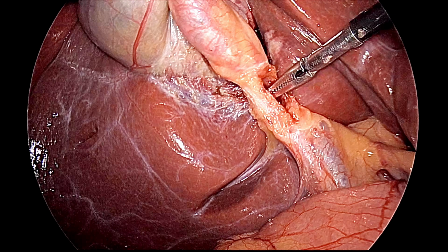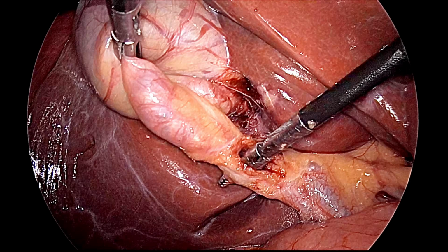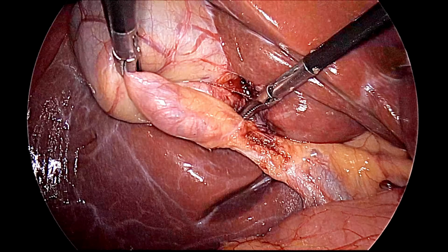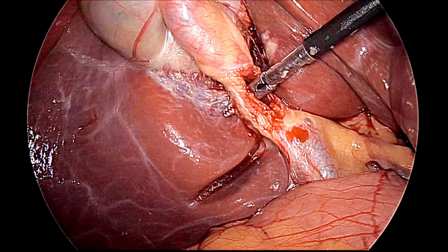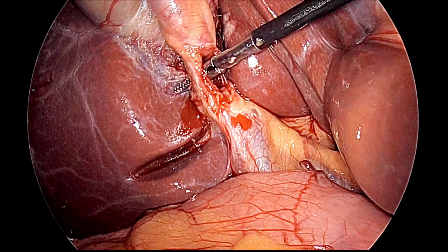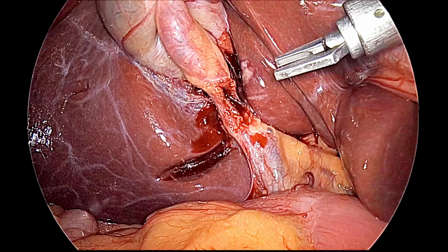So, this is the cystic duct and behind is the artery, and this is the critical view of safety. We can see this is the anterior window and behind is the posterior window, and now it is fully confirmed. And again you can turn the ICG mode on, and you can look at the duct and the CBD clearly.